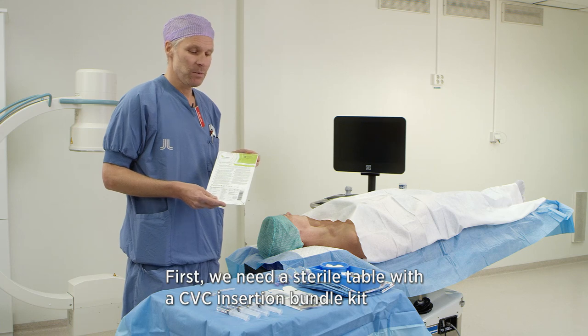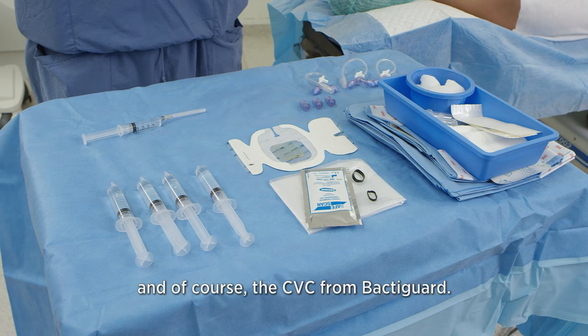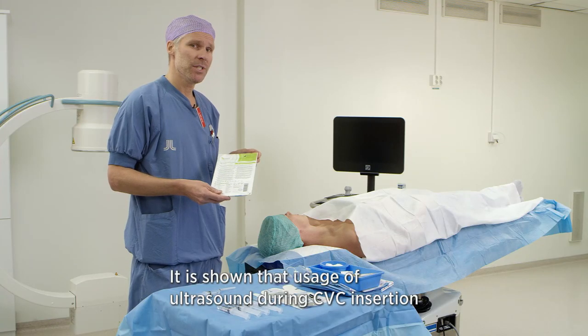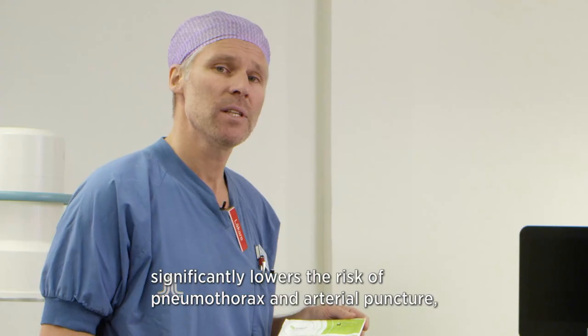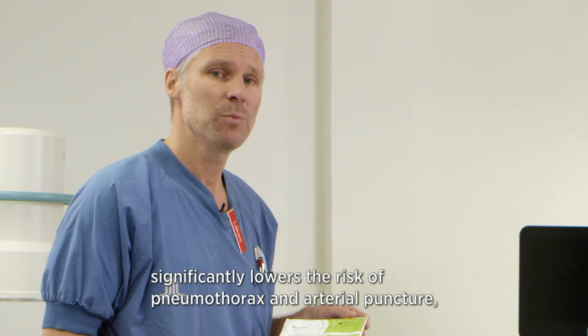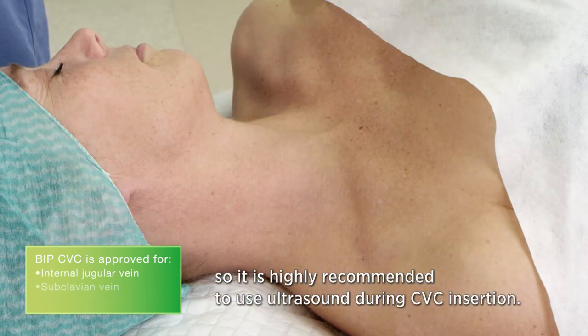First, we need a sterile table with a CVC insertion bundle kit and of course the CVC from BactiGuard. It is shown that usage of ultrasound during CVC insertion significantly lowers the risk of pneumothorax and arterial puncture, so it is highly recommended to use ultrasound during CVC insertion.